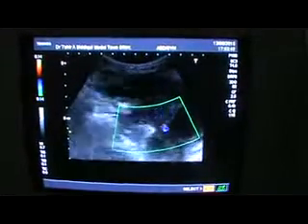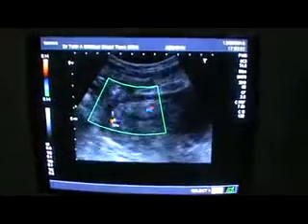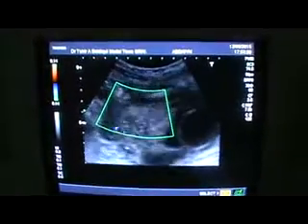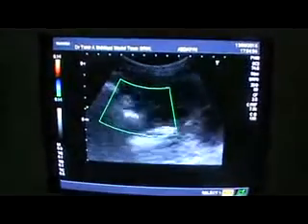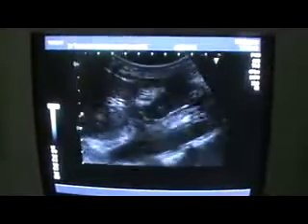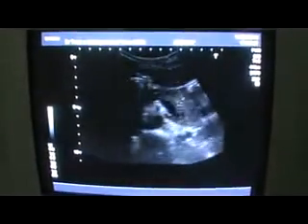So this is a very aggressive complex cystic and solid mass in the region of the pelvic cavity with cystic and solid components and thick mesentery around, with fluid in the right paracolic gutter that we saw, and no regional adenopathy, and there is no evidence of para-aortic adenopathy. This is the pancreas now.